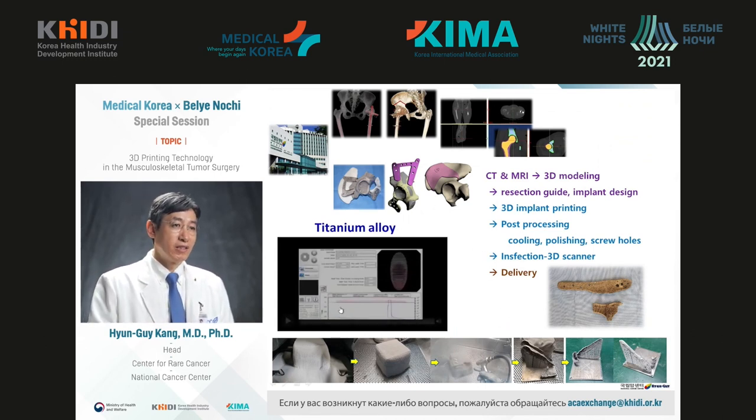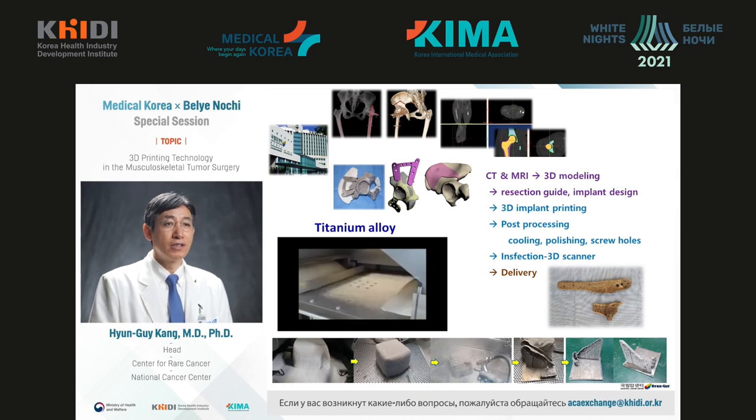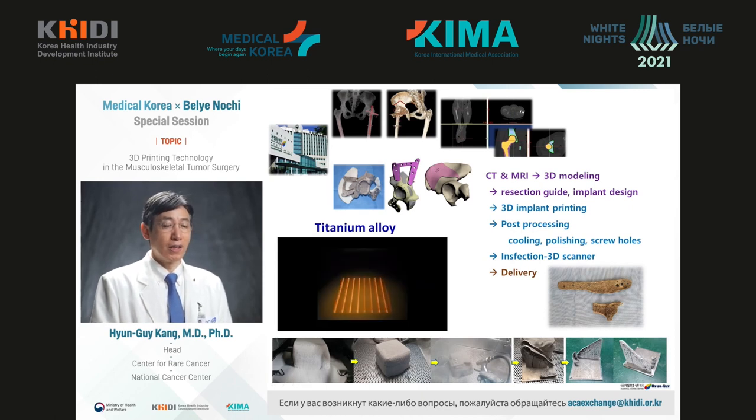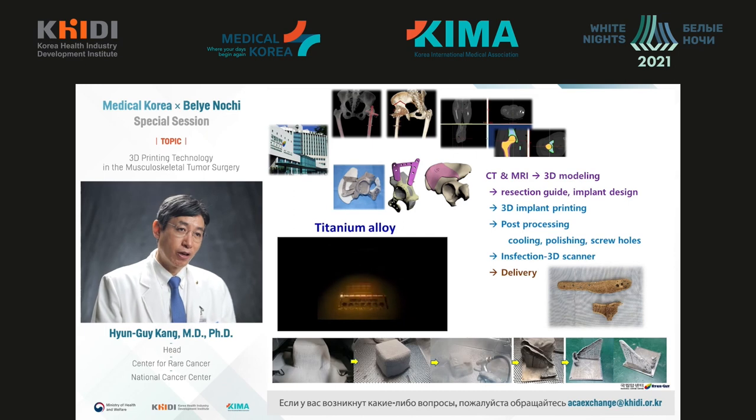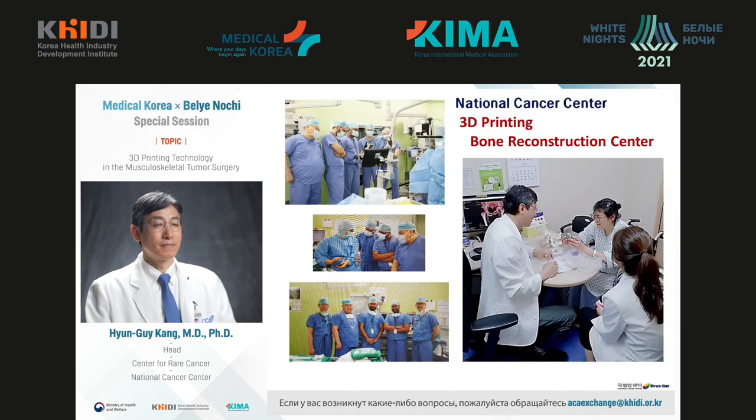We can say there are lots of cases where you can use surgery with 3D implants made of titanium alloy. In particular, we need to have very good collaboration with engineers experienced in computers. It's very important.